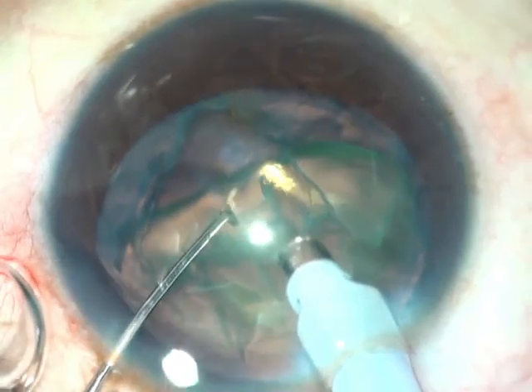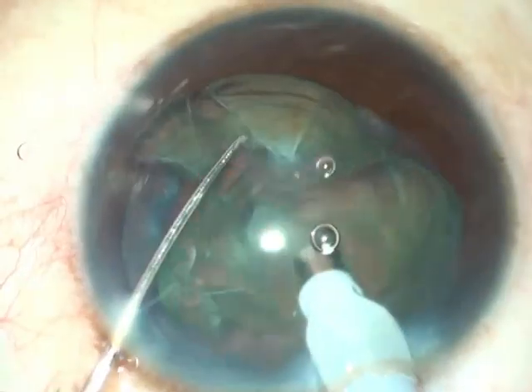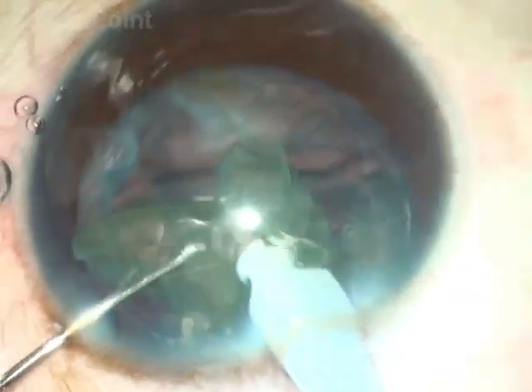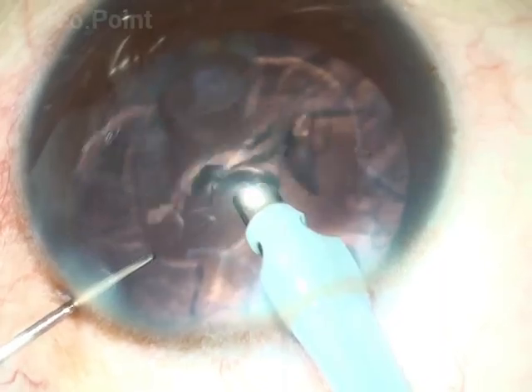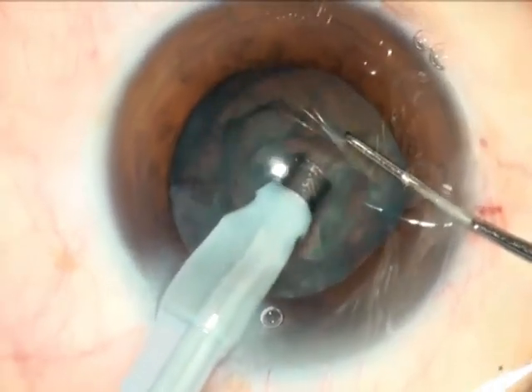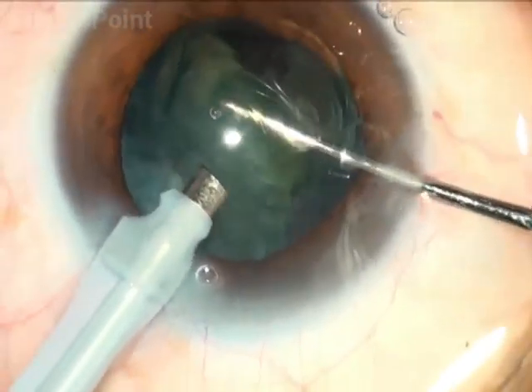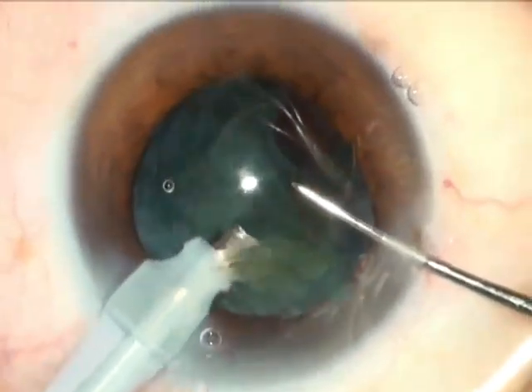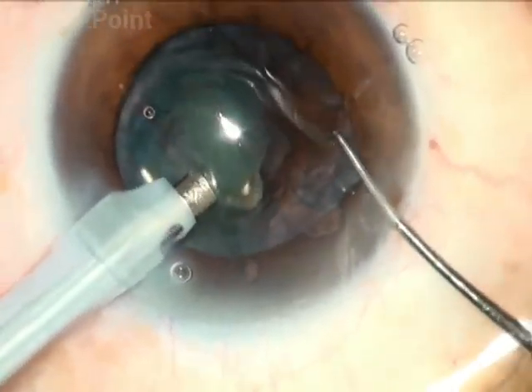In fact, attempted impaling of the nucleus results in the emulsification of the tissue being held. You often find yourself left with a large residual nucleus that does not have significant tissue, making it difficult to bring out of the capsular bag. When faced with this challenge, if you are able to get a hold of it you must maintain that hold, and with the help of a second instrument — as you can see here — once brought up, it is not allowed to fall back into the capsular bag. In this way the surgeon can carefully and comfortably complete the nuclear emulsification.